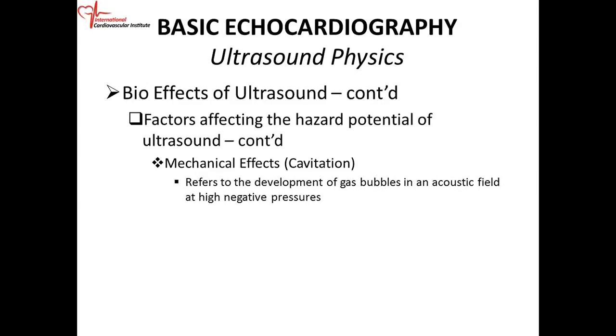So the mechanical effects, as we said, tissues that have more gas and fluid are more prone to the cavitation effect of ultrasound. The mechanical effect, or cavitation, refers to the development of gas bubbles in an acoustic field at high negative pressure.